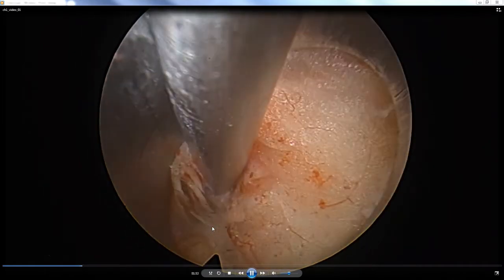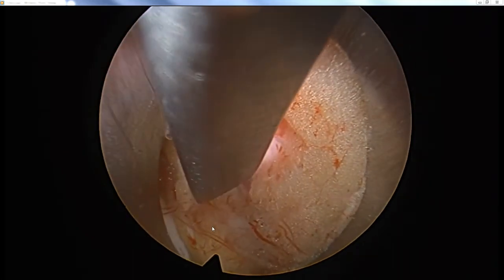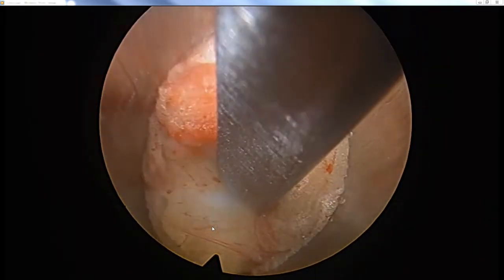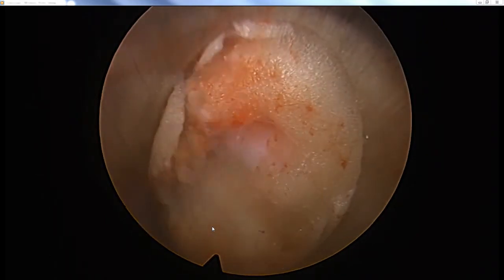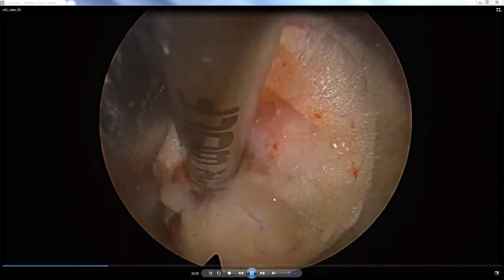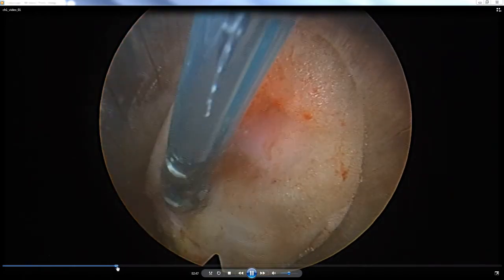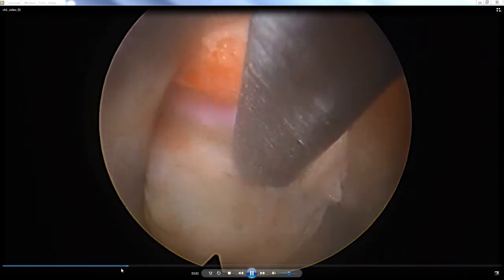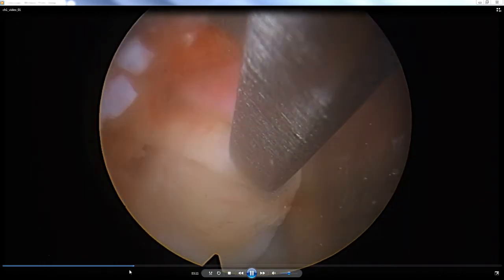This tool is called a freer elevator. I put this in to start mobilizing the nerve root off of the disc herniation. Initially the nerve root is pretty stuck down — we don't see any pulsatile movement, which is important because normally nerve roots do need to move a little bit. The white coming into view underneath is the actual disc herniation itself. I take a couple of passes with the freer elevator to make sure the nerve root is starting to be freely mobilized. I use the shrinker to coagulate vessels so there's no bleeding — this entire operation is done with less than about a cc of blood loss. Once the nerve root is free, I turn the cannula slightly to keep it out of the way and protected, exposing just the disc material.